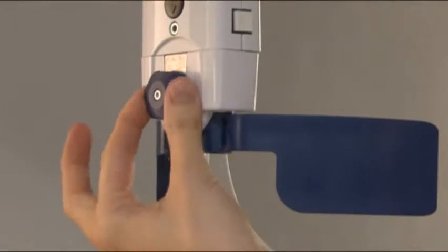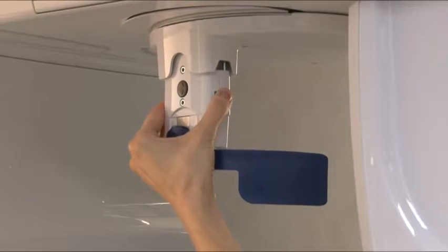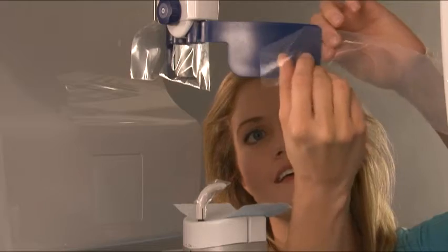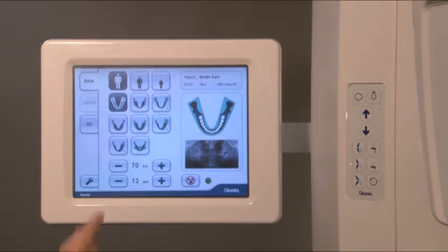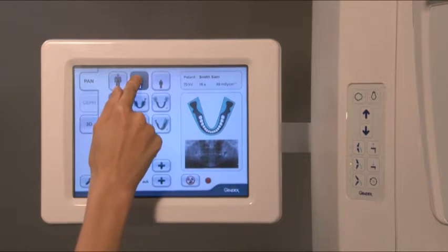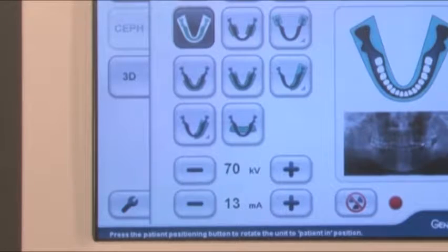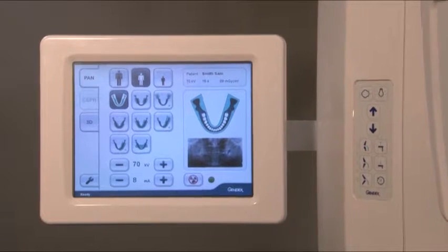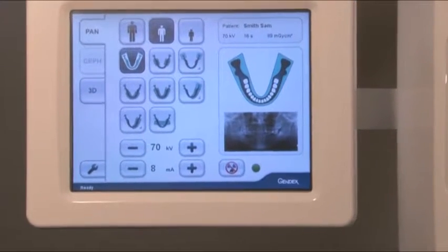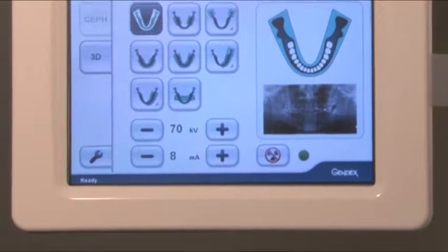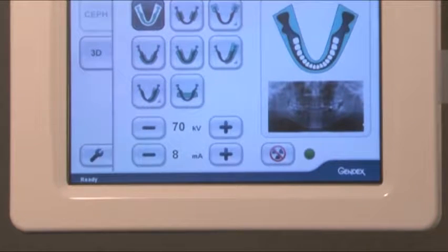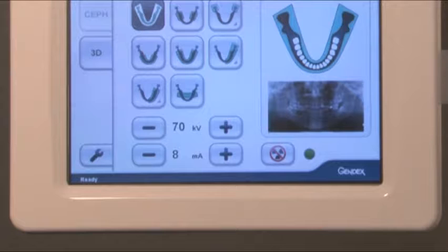Open the head support by turning the knob, then pull the head support assembly fully forward. Place barriers on the head supports. Ensure that the pan tab is selected, then select patient size. Select the appropriate projection button. Exposure settings are predetermined by selecting patient size and projection; however, kilovolts and milliamps can be adjusted at this time. If small panoramic is selected, the width of the image is reduced.